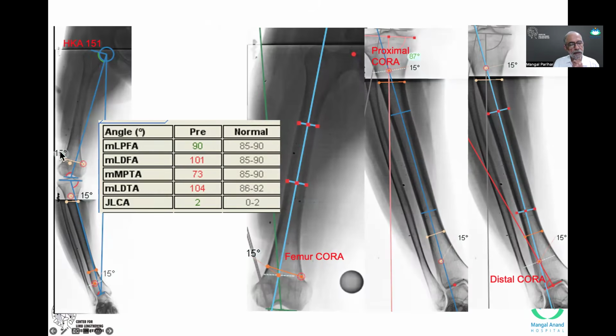That means there is some varus in the distal end of the femur. And the MPTA is also abnormal, 73. The LDTA, lateral distal tibial angle, is also abnormal. So she has some deformity in the proximal tibia, some deformity in the distal tibia, and some deformity in the femur.